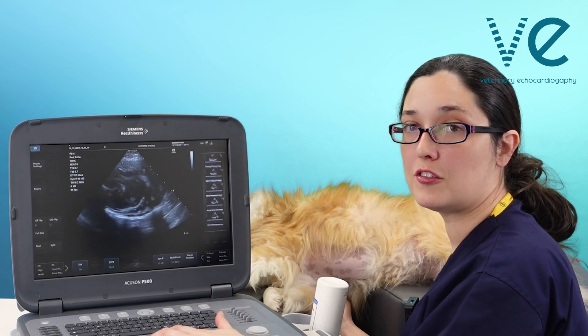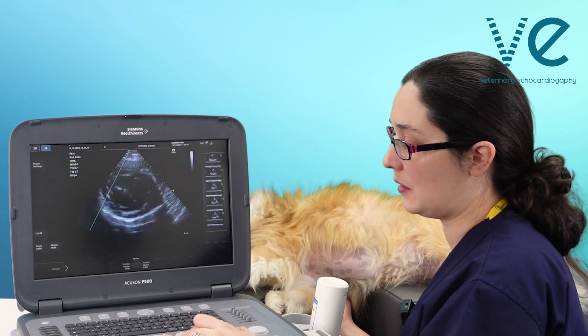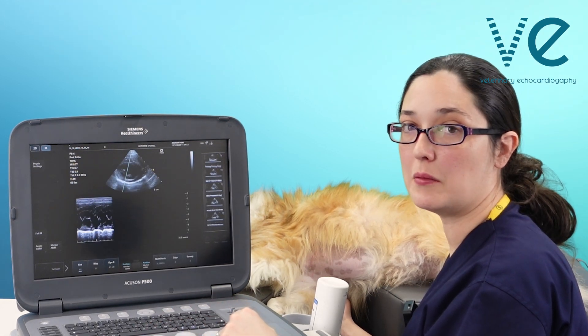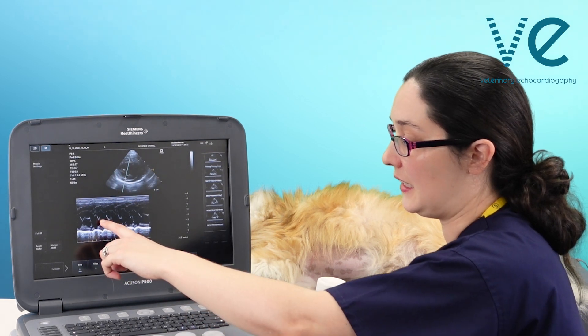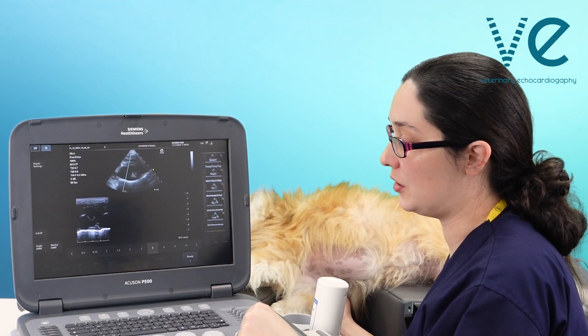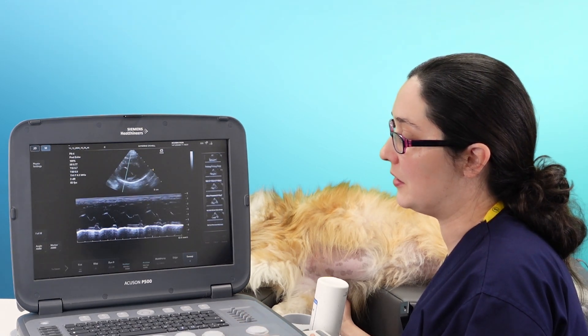From the short axis view, I'm going to do the same thing — getting my M-mode cursor, putting it through both leaflets, and obtaining my M-mode trace with my E and A waves. Again, I can change the sweep speed if I want to, to make it easier to measure from.